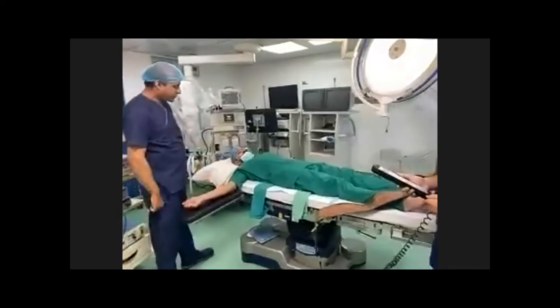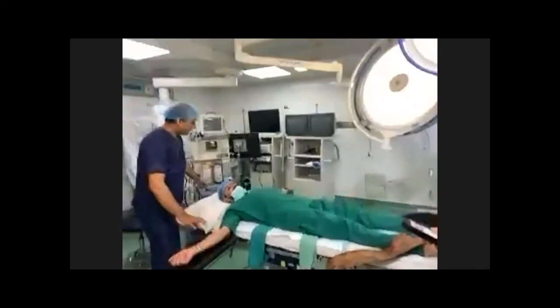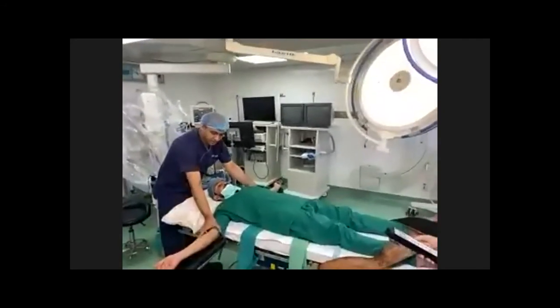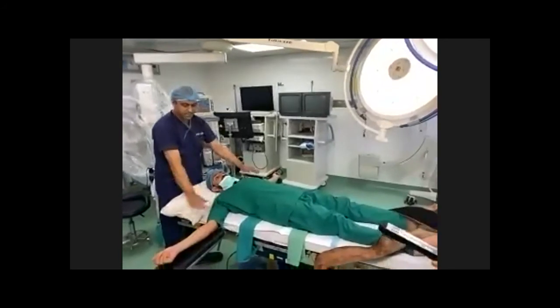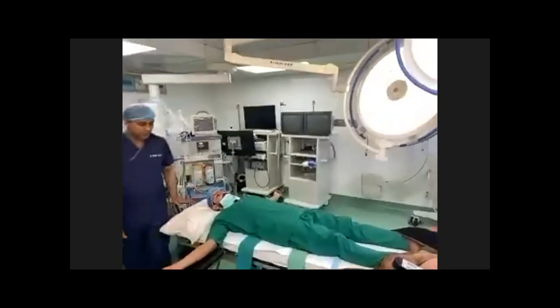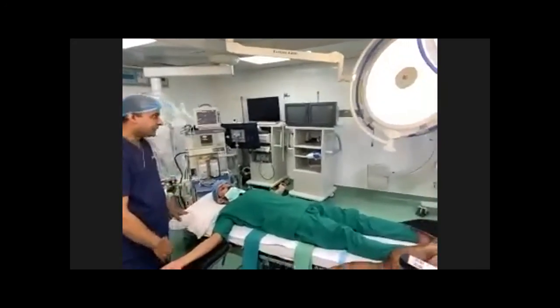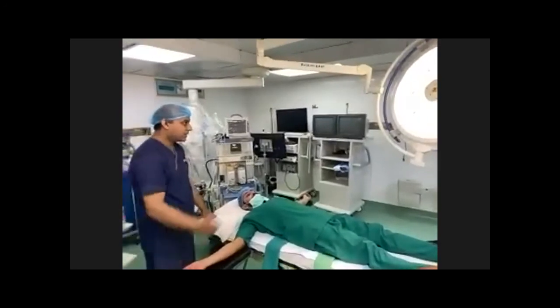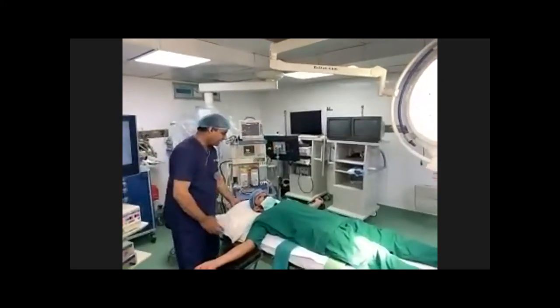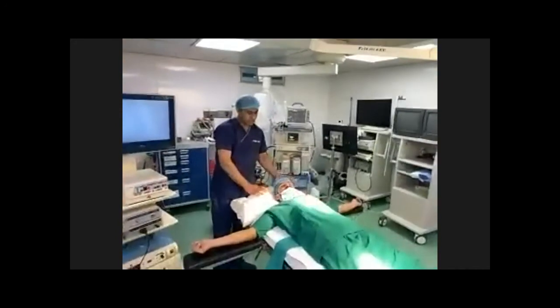The patient is lying flat on the bed. His arms are wide apart on the armrest, and they are almost at 90 degrees. This pillow has been put to give comfort to the patient. Different anesthetists and different doctors do it differently. They put a head ring beneath the head as well.